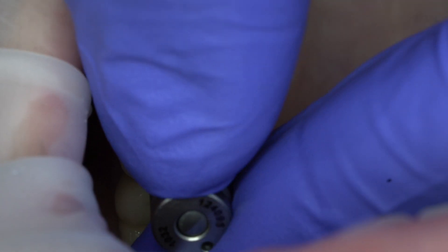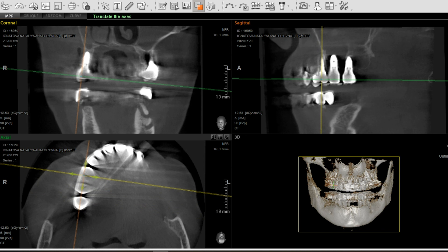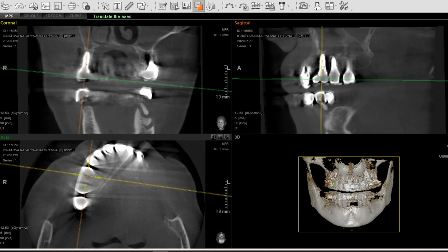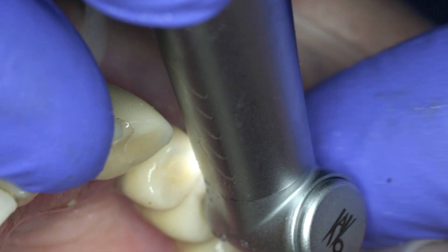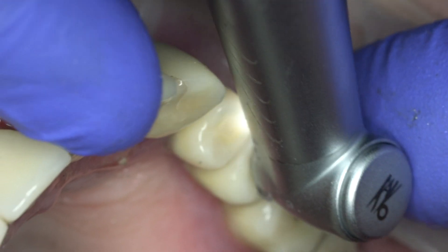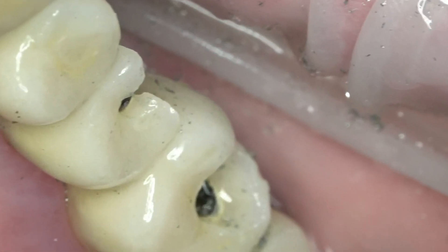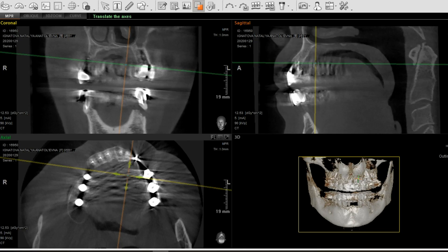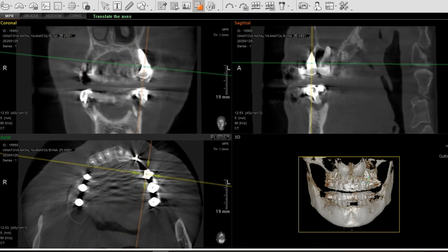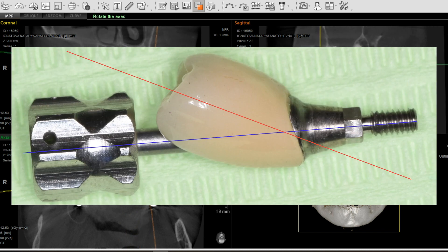A more difficult situation is the alignment of the implant axis with the crown axis, but without a central position of the screw projection. In such a situation, trying to save the cusp, it is not always possible to correctly position the entrance hole. As a result, the occlusal surface has to be opened wider, and the hole comes out larger than expected. The most unfavorable situation is the misalignment of the axis of the coronal part and the axis of the implant.